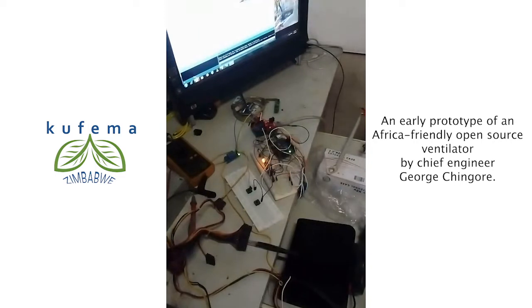So yeah, these are the electronic components, the brain of the whole thing, with the two buttons, which I use to change the operational mode of the system. So yeah, without wasting more time, let me do a quick demo.